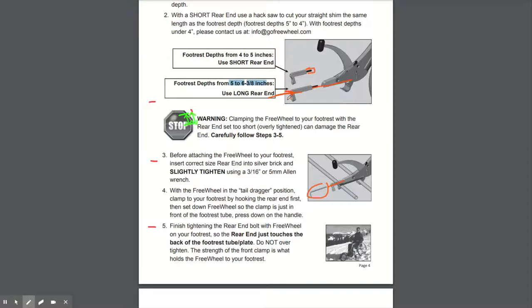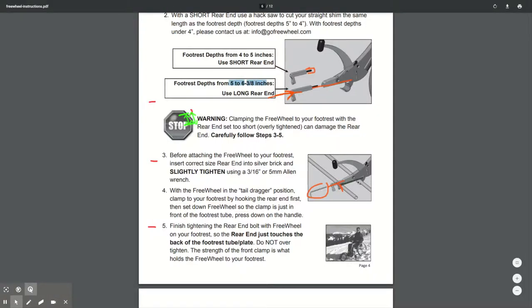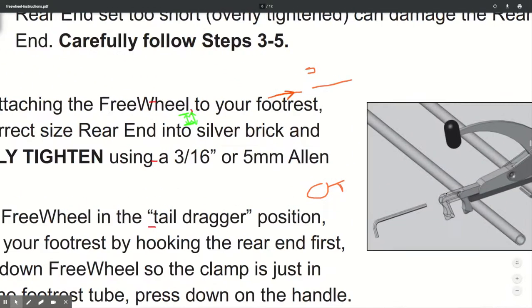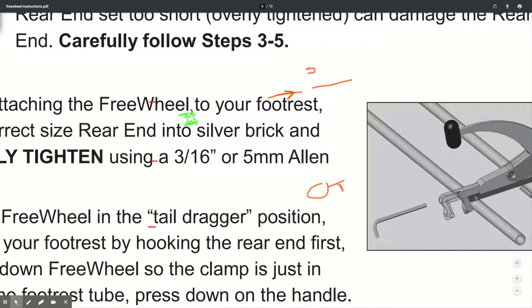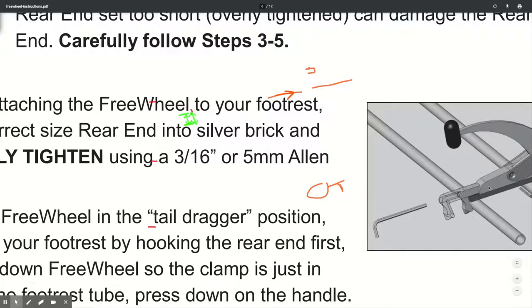you may find it to be stiff. So you'll put the Allen key in, you'll tighten it, and you're tightening it against the shim. So you're tightening it all the way in so that it touches the shim, which is then the depth of your footrest. You may find it tight because you've got to get past this lock nut.